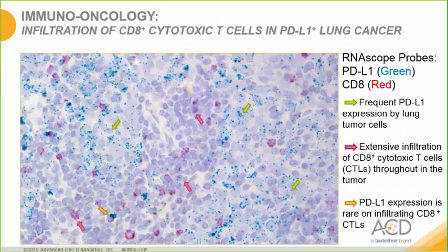As we saw on the last slide, RNAscope most often appears in oncology publications, especially as PD-L1 and other markers for companion diagnostics are a hot topic these days. This is an image of non-small cell lung carcinoma that has been stained with an RNAscope green and red duplex chromogenic assay. The lung cancer cells express PD-L1 as evidenced by the green signal in the tumor cells with larger nuclei.